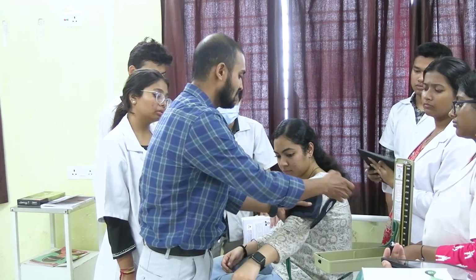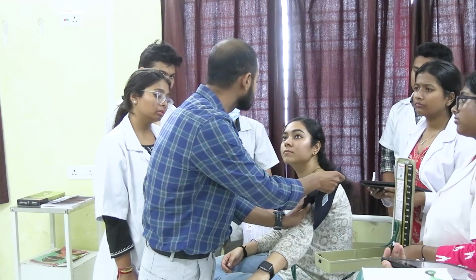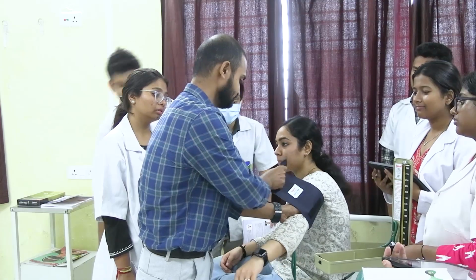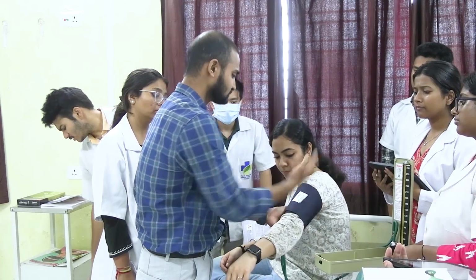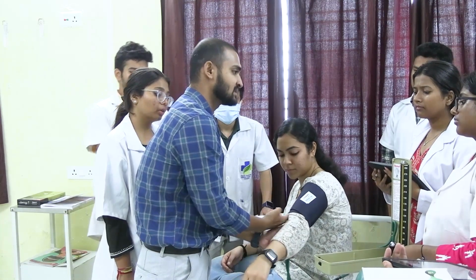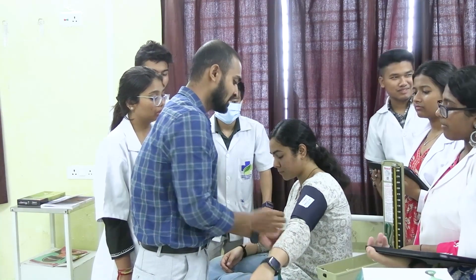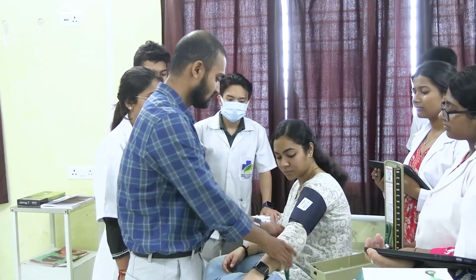How will you understand it is too tight or too loose? It should be such that it doesn't slip off. At least 2 fingers should be going inside. See, it's freely going inside. So this is not too tight, not too loose. Okay, fine.